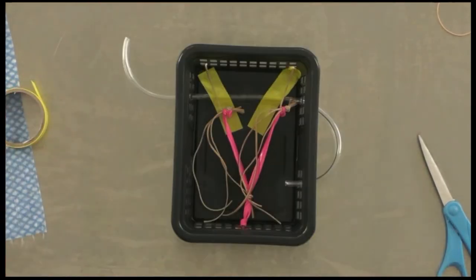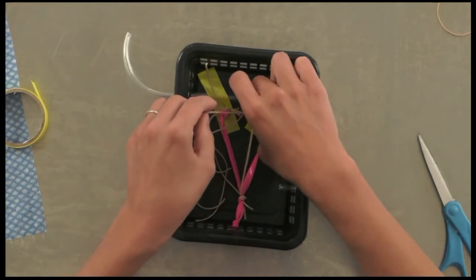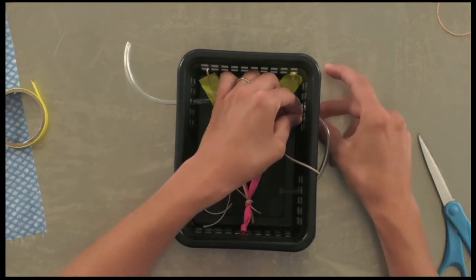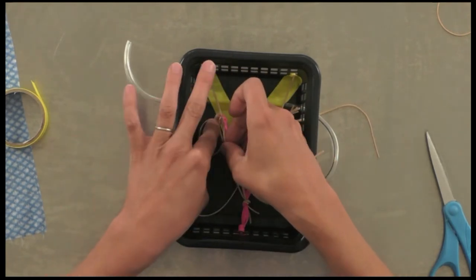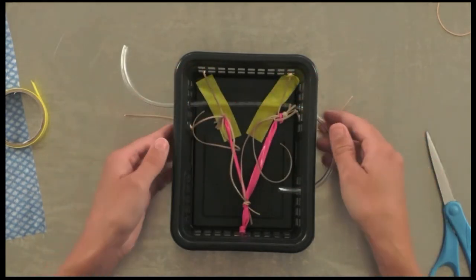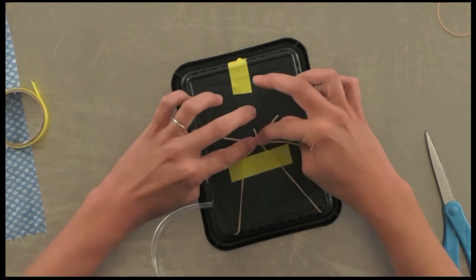For the ovarian vessels — part of your pedicle — you want those to come out the side of the basket, directly adjacent to the ovary on that side. Let them come out the side; these ones you want to be a little bit loose. Just pull up on your ovaries to the level of the basket, flip it over to show they're loosey-goosey, then secure with tape.